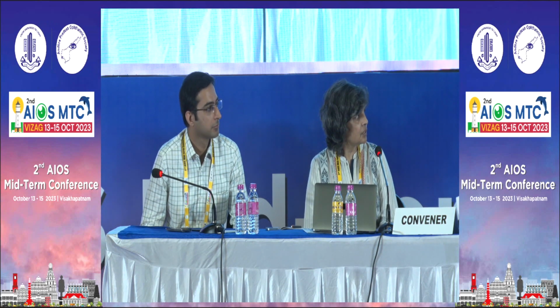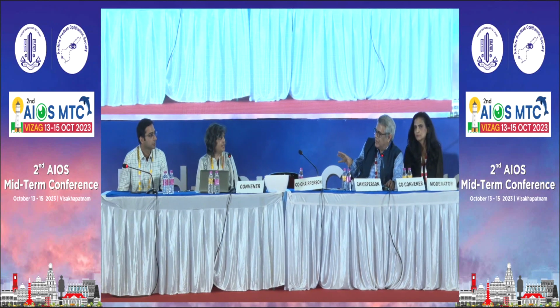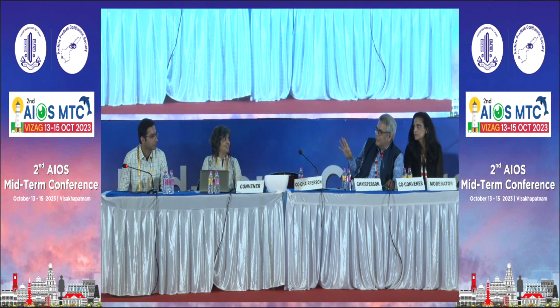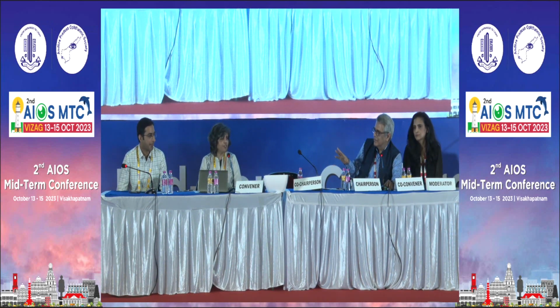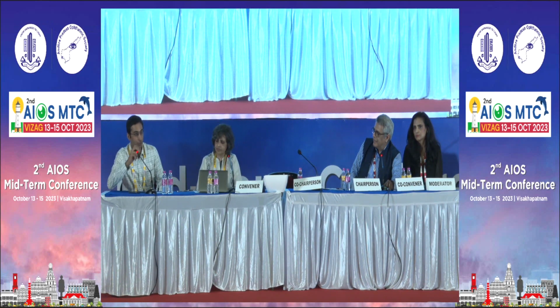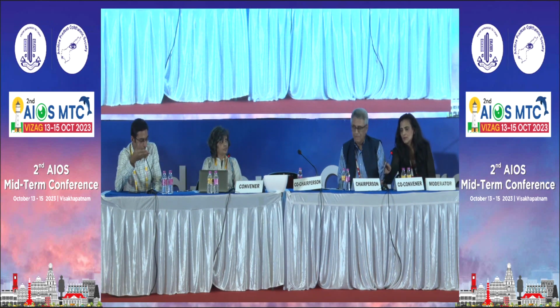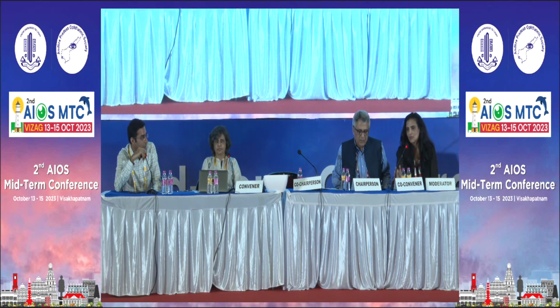I will not, because to pick up a subtle NVE, you have to do a laborious job. NVD is okay. Because 4 or 5 minutes of angiography will reveal more wealth of information. Only NVD I was saying. I totally agree, because FFA still is an investigation which is usually backstage. But FFA really is important, and the role of FFA would be highlighted in the next talk also.